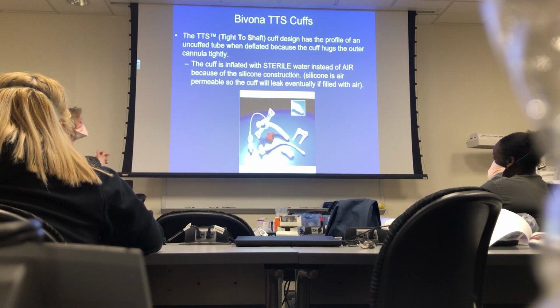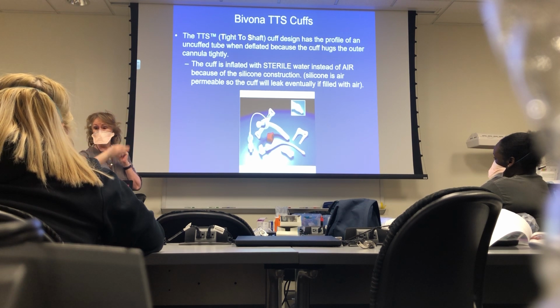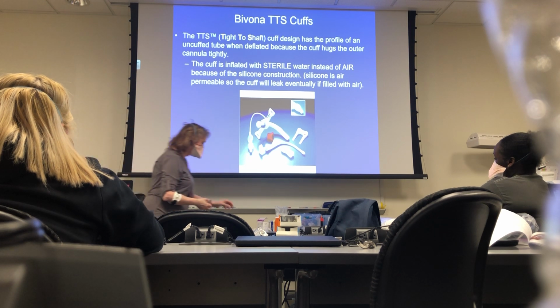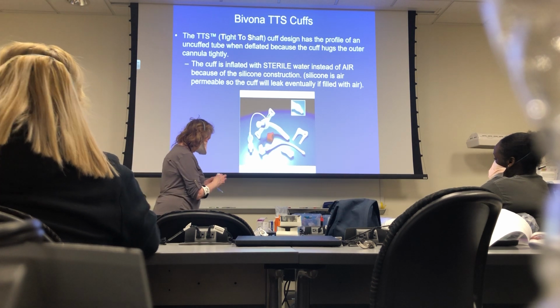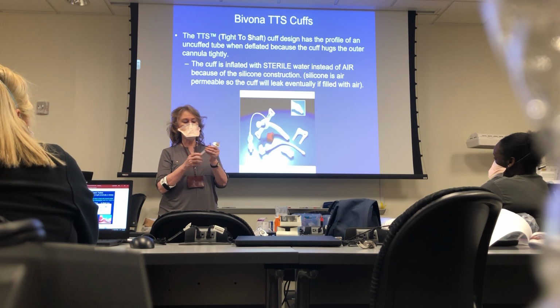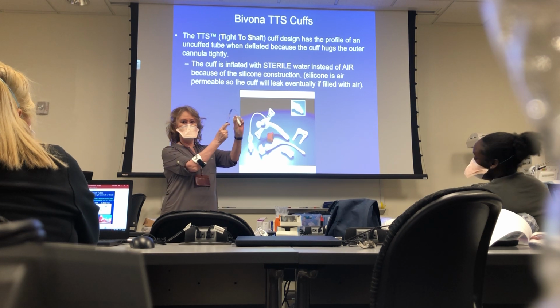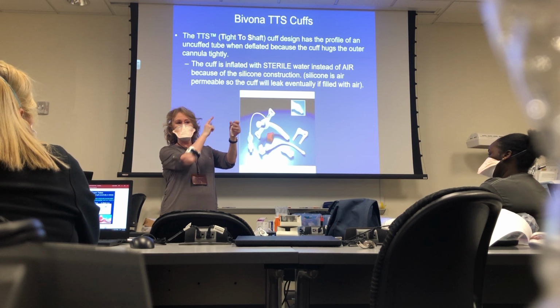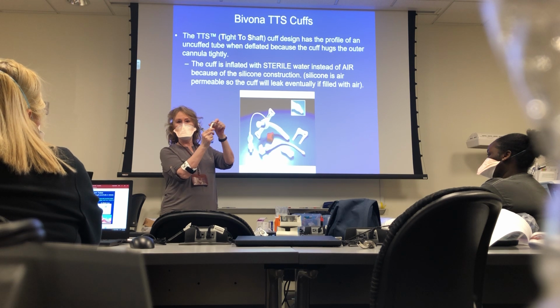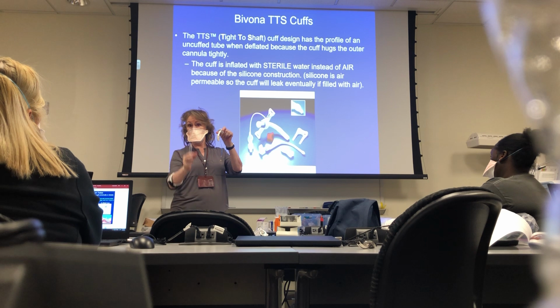So these are special trachs designed so that when the cuff is deflated, there is the minimal amount of resistance around that tube. When I deflate this one, it doesn't really go flush against the trach. See all the wrinkles? When you deflate these, you can barely see that balloon. It's flat against the tube, so there's no resistance around that.